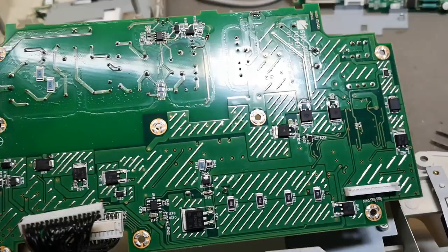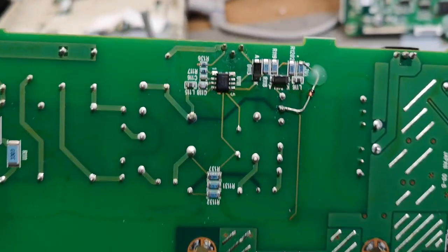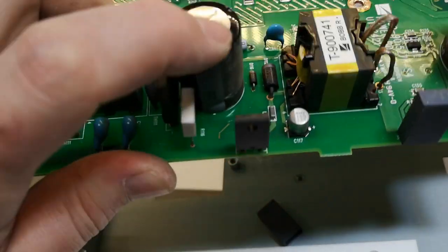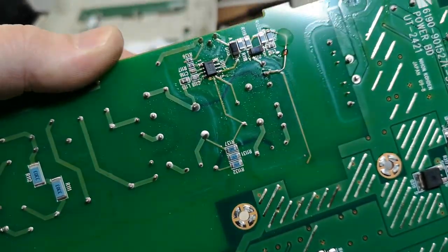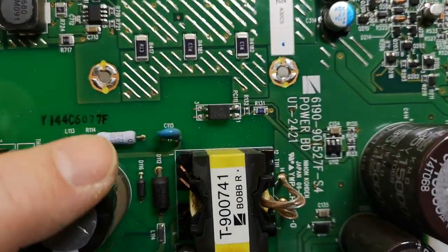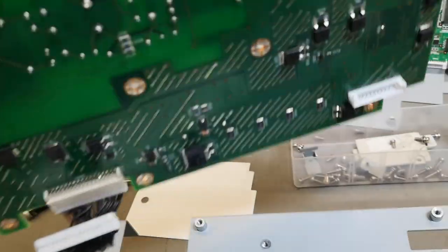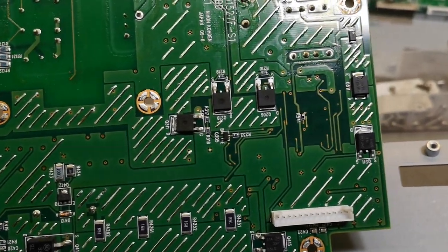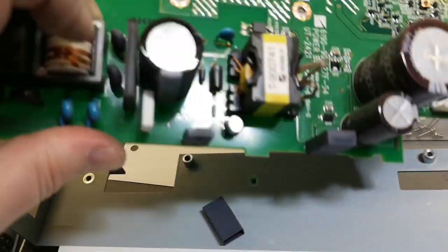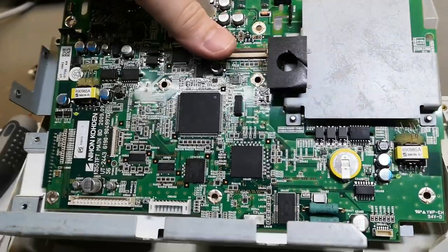This is the bottom side of the power supply. There's a little power supply regulator IC handling the PWM for the flyback — most likely an offline flyback controller. Then there's an optocoupler for voltage regulation and all that. Quite a lot of transistors here, probably for enabling different voltages. A beautiful power supply.